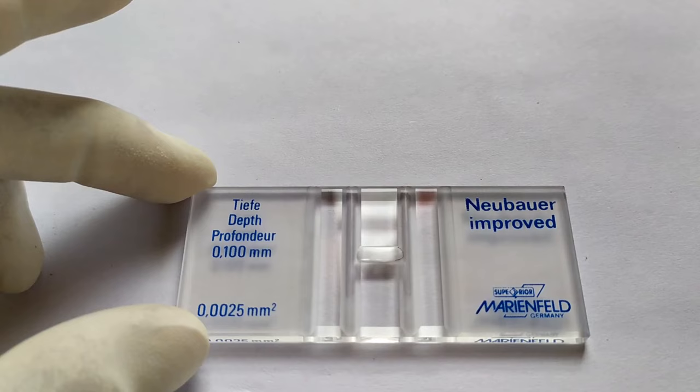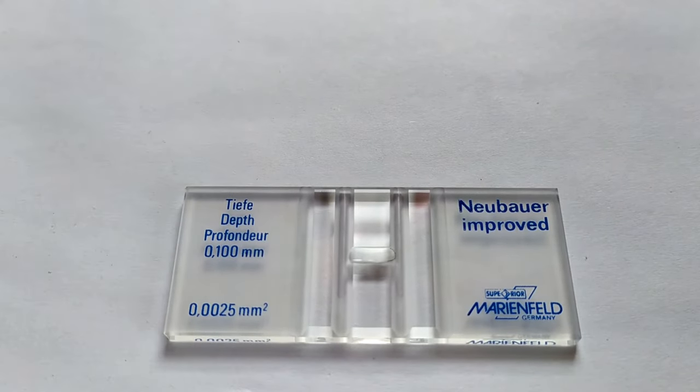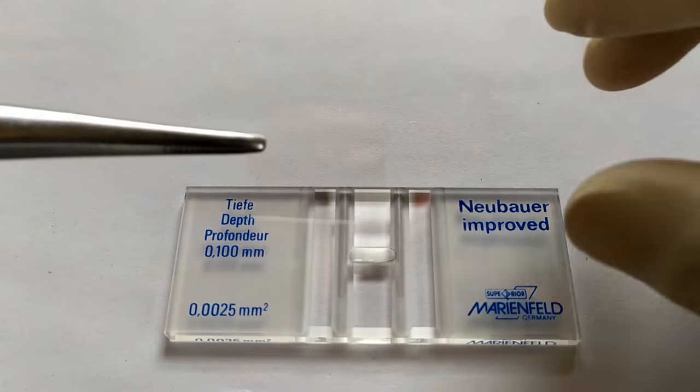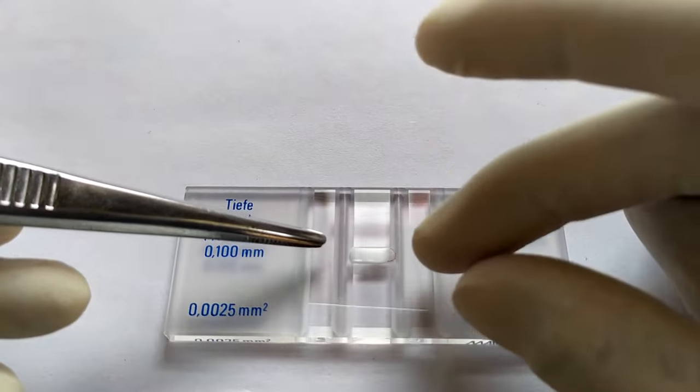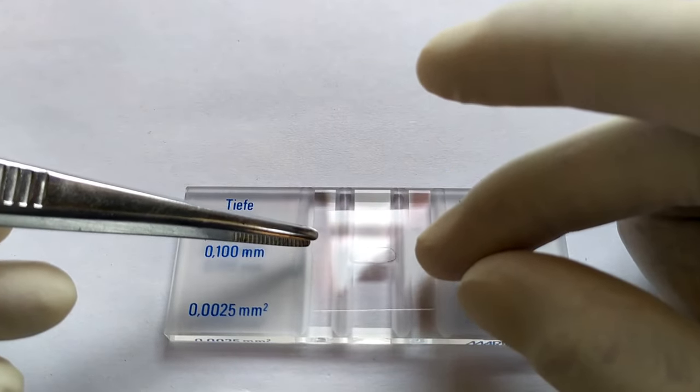Once this is done, prepare the counting chamber for sample loading. Take the counting chamber and the cover slip, both pre-cleaned with alcohol. Carefully position the cover glass on top of the support platforms located on both sides of the counting chamber.